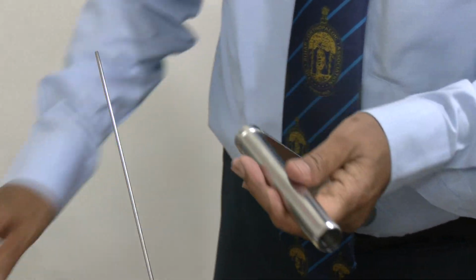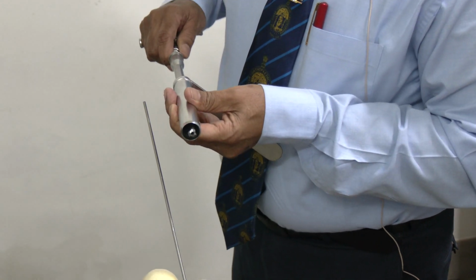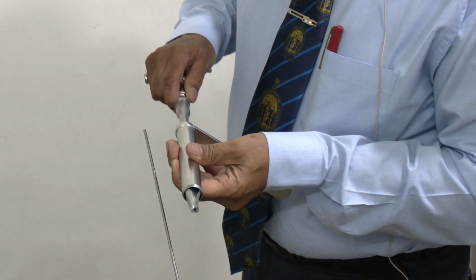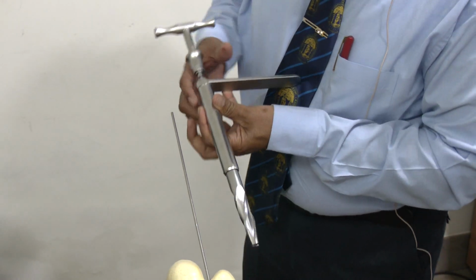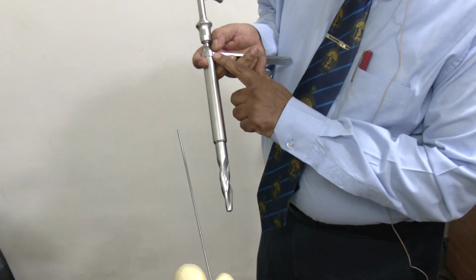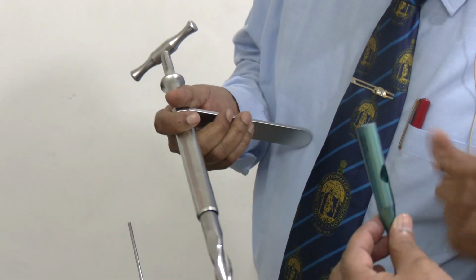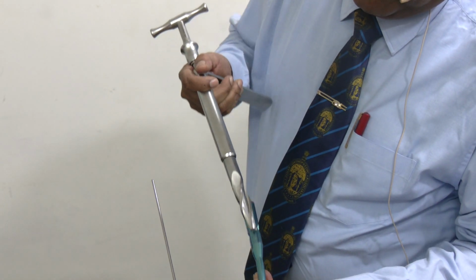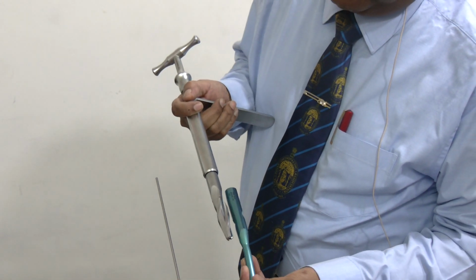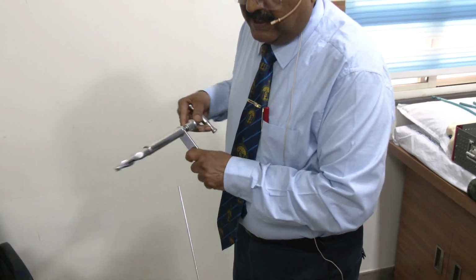Internal diameter is 16.5, so that this 16.5 millimeter reamer can pass. Then there is a stopper. Nail dijiye. So the stopper prevents pushing of the centering awl too much inside, and whatever is the required, the expanded proximal portion of the nail, this will ream only that much. So that's the advantage of this.